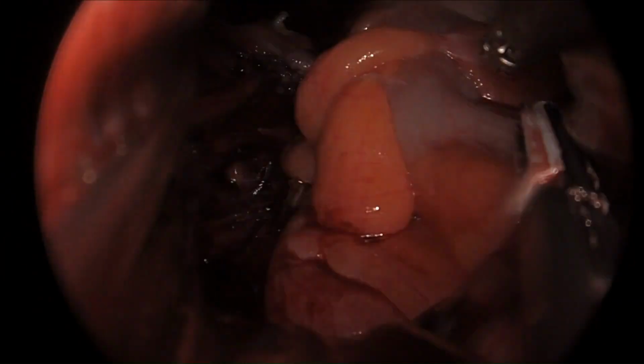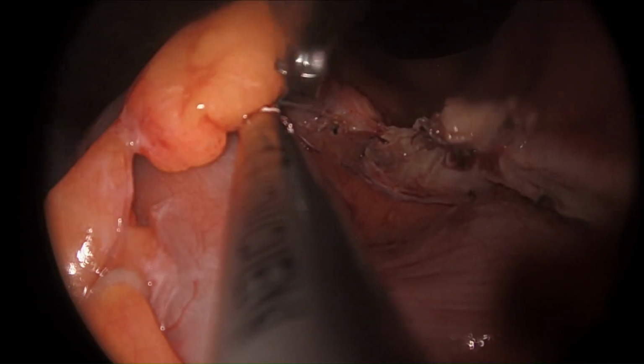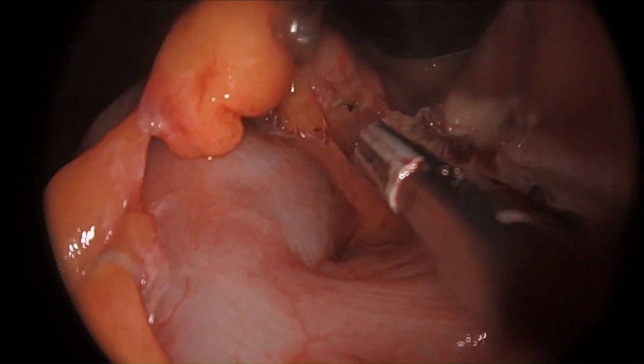After completing the right pelvic lymphadenectomy, the same procedures were performed for the left pelvic lymphadenectomy.